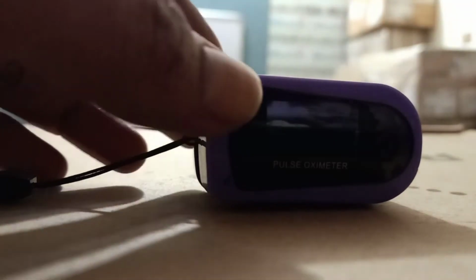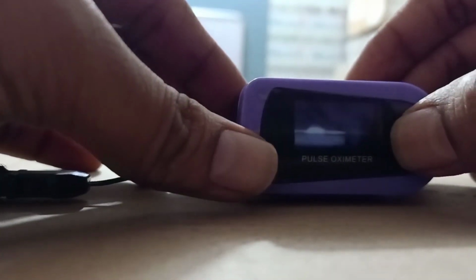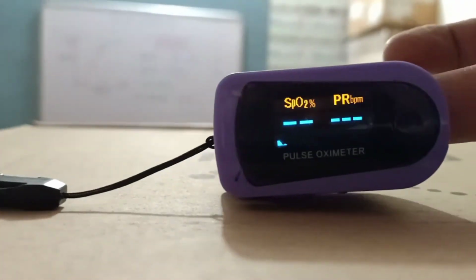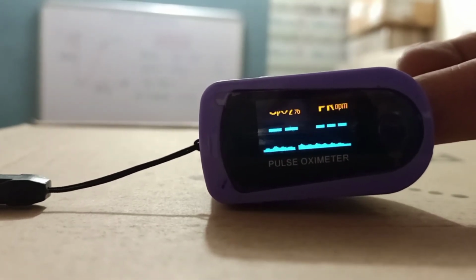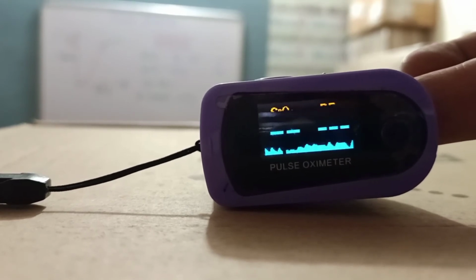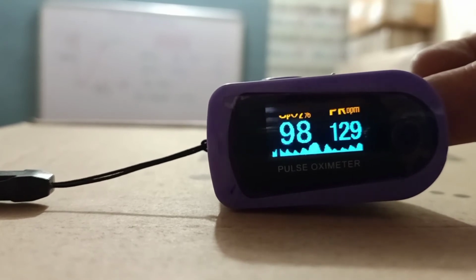Now I will show you the real-time checking of the pulse ox. There is a button here which you can see, which I am pressing, which puts on the display, and I put a finger on here, and you can see there are two values, SpO2 and PR, which is BPM, beats per minute. PR is for pulse rate. And you can see you have to wait for a little time for it to be recorded nicely, and you can see the waveforms coming very nicely.